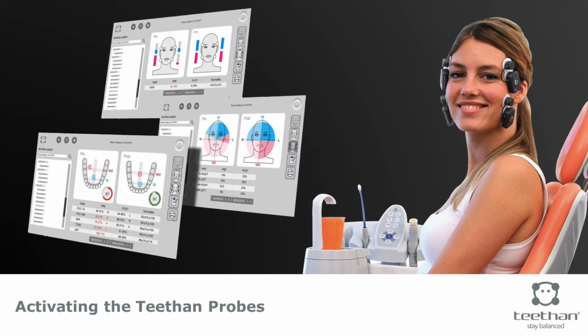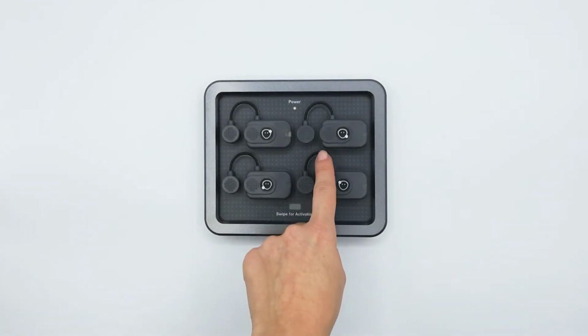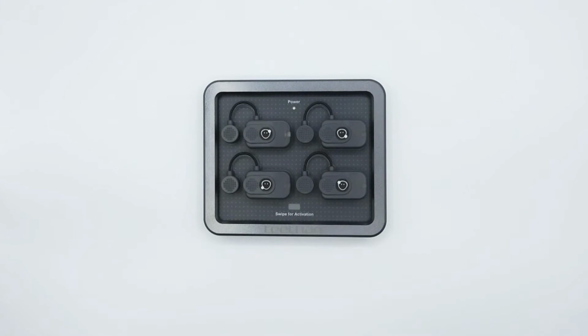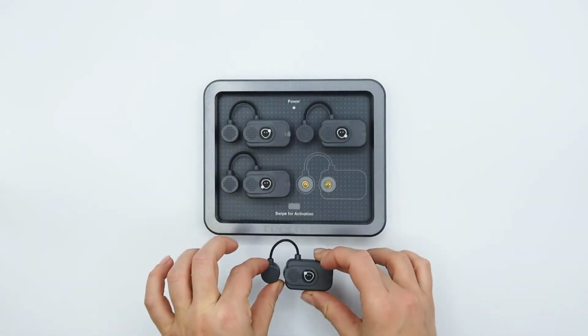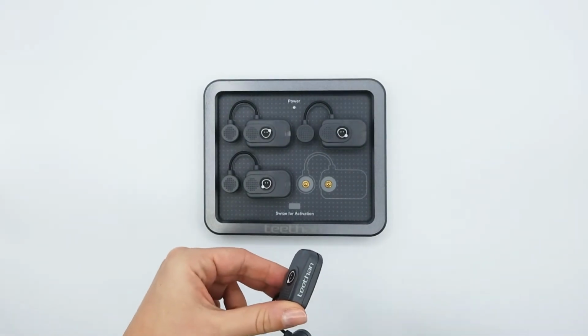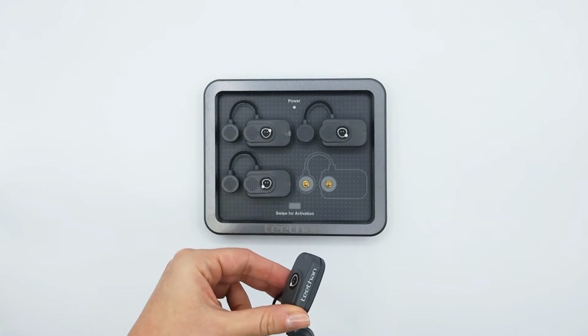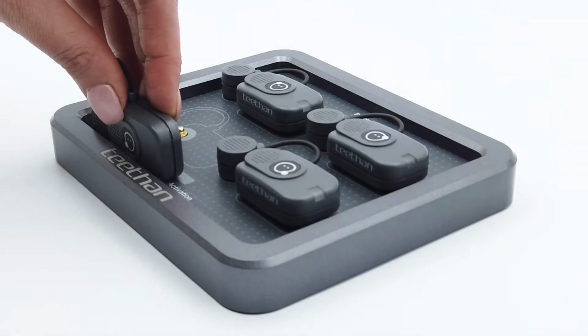Activating the Teethan probes. The probes are composed of a mother electrode and a satellite electrode, which are connected by a small cable. To remove the probes from the charger, please avoid stretching the cable and disconnect them in this way. The probes have a magnet placed under the brand name Teethan. To turn on the probe, swipe it across the area called Swipe for Activation, like so.